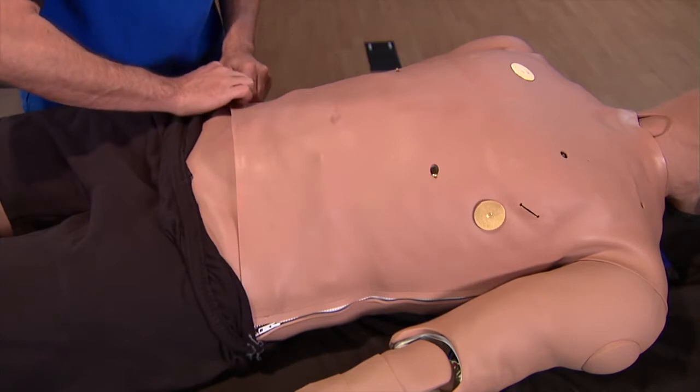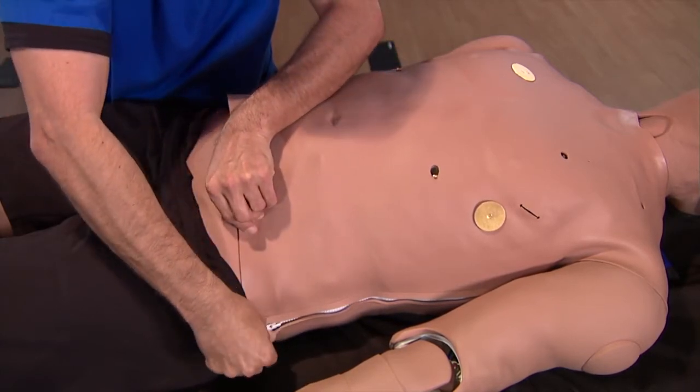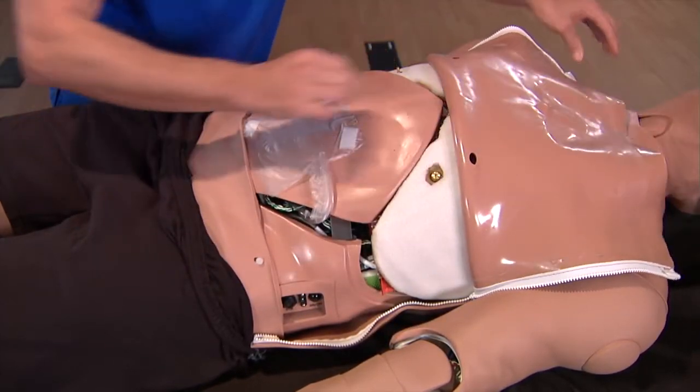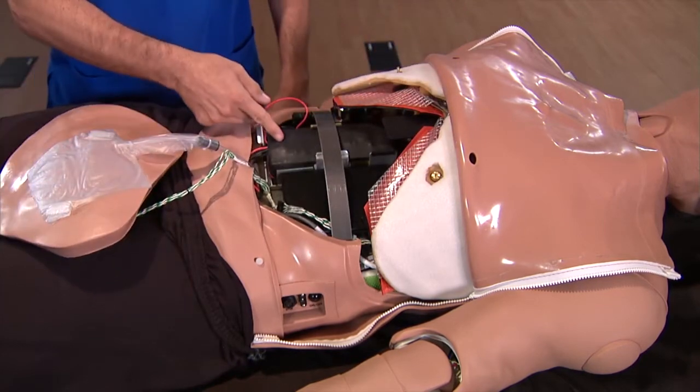Lower the waistband of Mediman's shorts to uncover the lower edge of the abdomen. Unzip both sides of the skin of the torso, then fold the skin back to uncover the abdominal insert. Set the abdominal insert aside, but keep the tether attached.